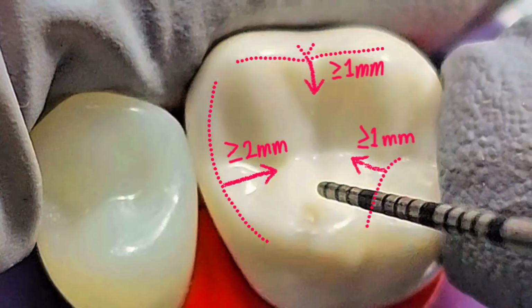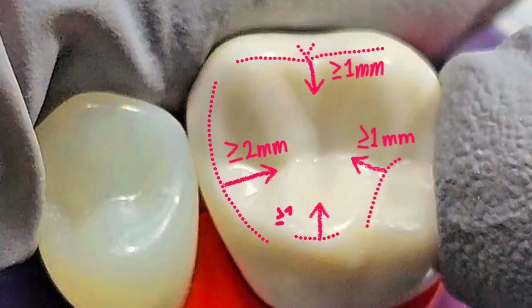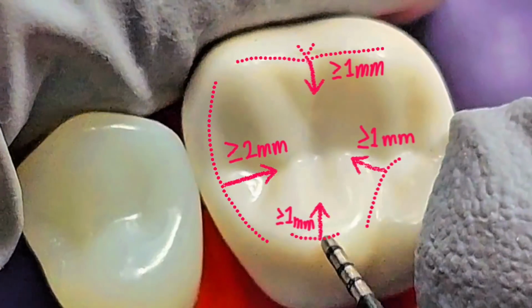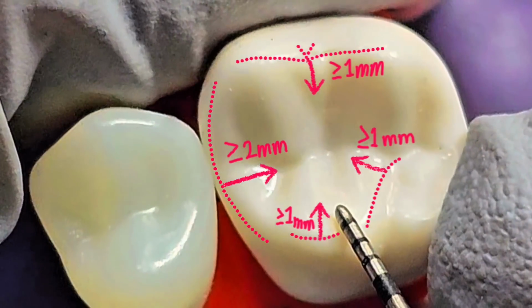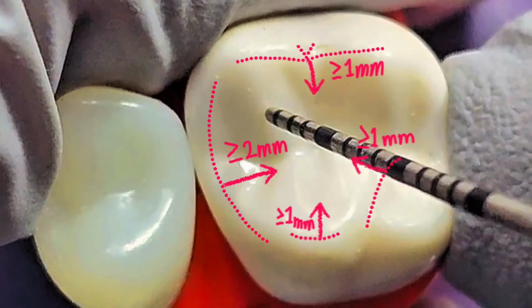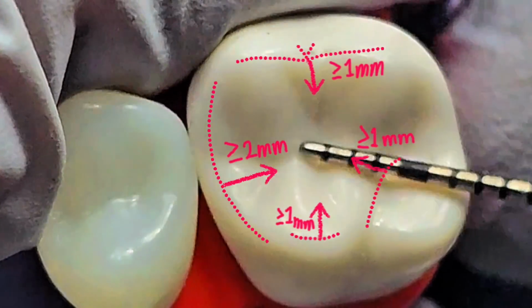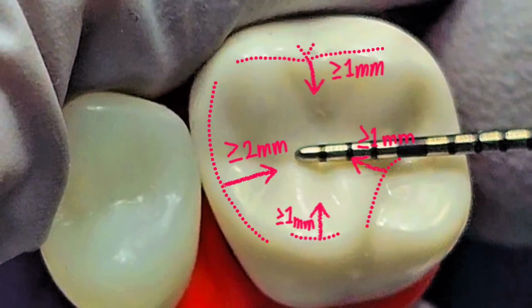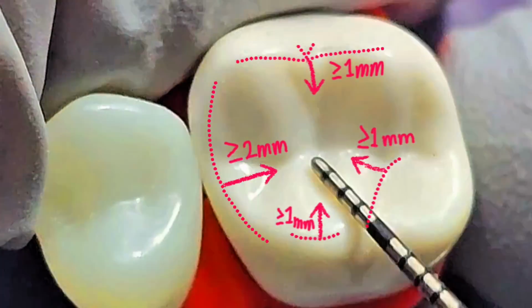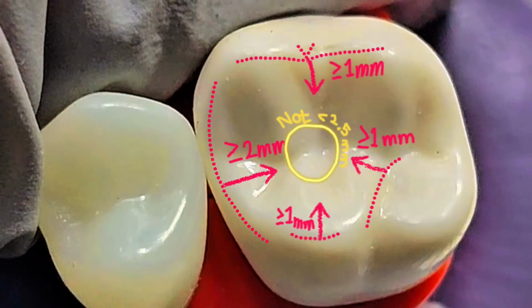And also the palatal extent of the access preparation is greater than or equal to 1 millimeter from the mesiolingual cusp tip. So if you measure from here, it is 1 millimeter or greater. That is the extent that we can give, but the preparation should not be smaller than 2.5, mesiodistally and lingual-buccally.